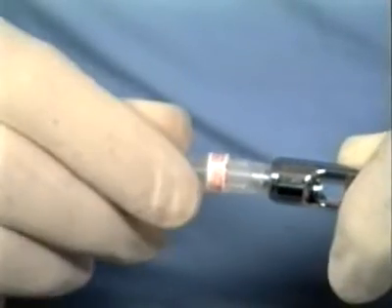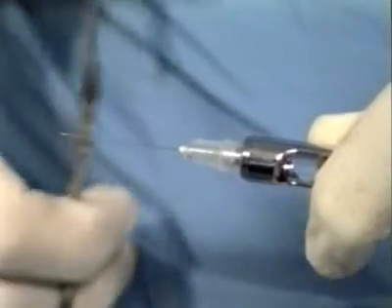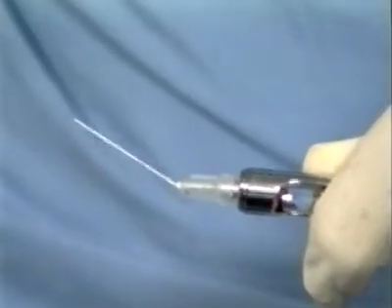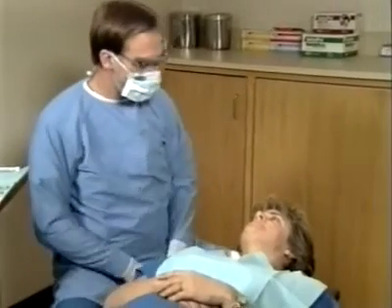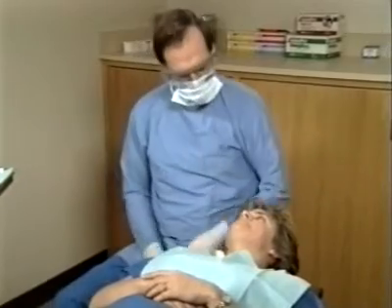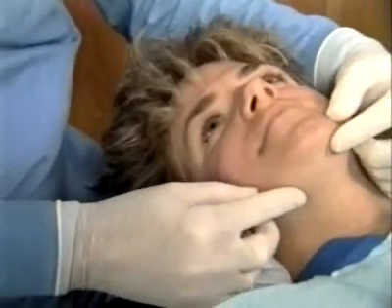Clinically, the 25-gauge long needle used for the injection can be bent 30 degrees at the hub to facilitate medial insertion. Because this action weakens the needle, the patient must be cautioned to remain still during injection, and the needle must be advanced gently through tissue. The 11 o'clock position may be used for both the right and left high tuberosity block.